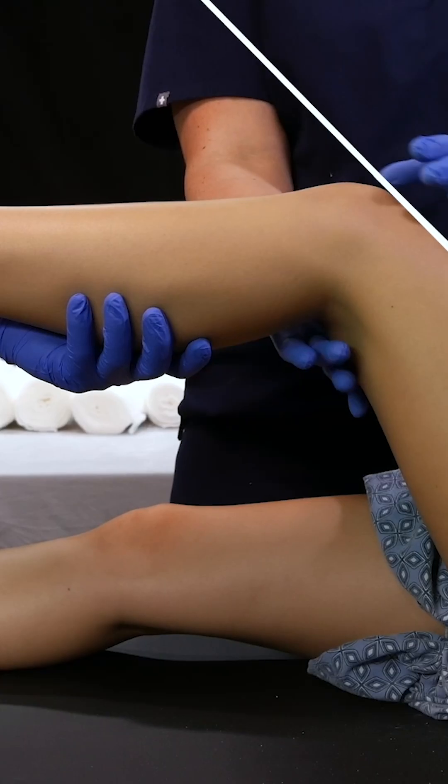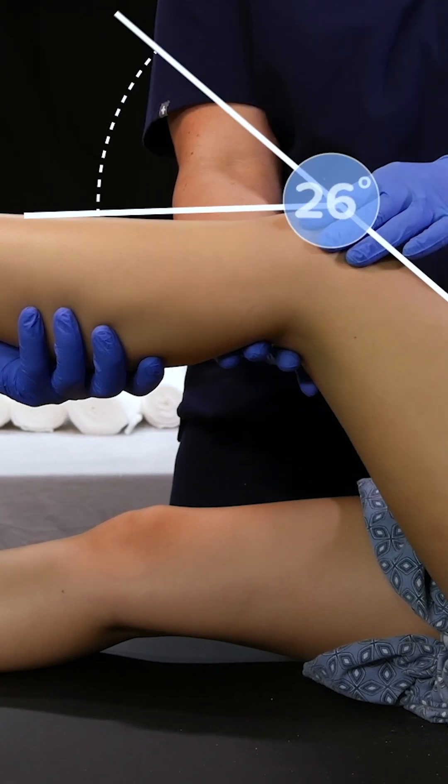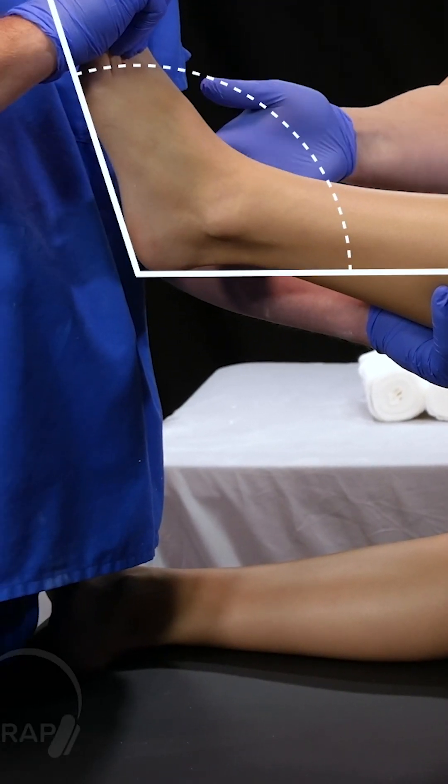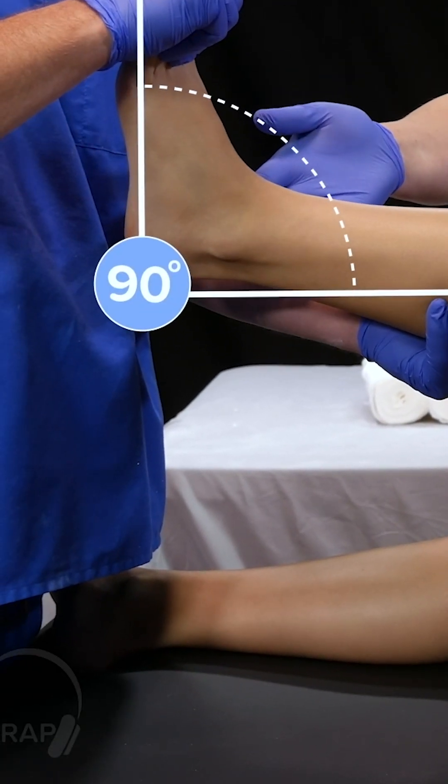Let's review a posterior long leg splint. The knee is going to be at 10 to 20 degrees of flexion. The ankles are going to be at 90 degrees. And you can use this for many injuries.